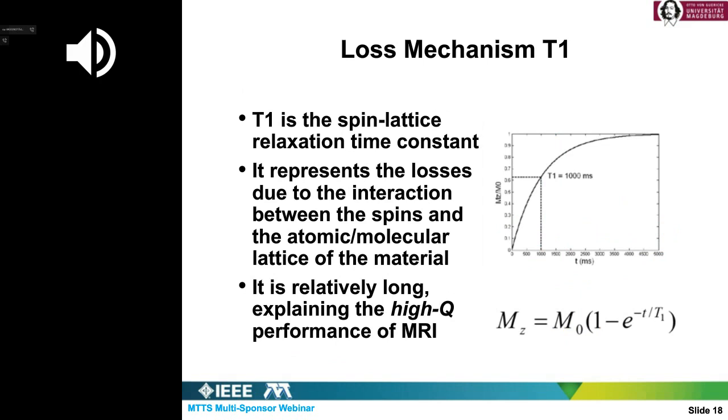If you look at this view graph here, the horizontal axis is the time. Imagine now, and the vertical axis is the magnetic dipole moment in the Z direction. Imagine that you brought it to zero by flipping all spins to the horizontal or transverse plane. Okay, now you stop exposure and they will return to the equilibrium, which is the maximum Mz along the applied magnetic field, by a time constant which is called in the magnetic resonance community T1.